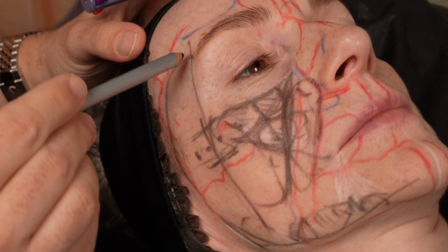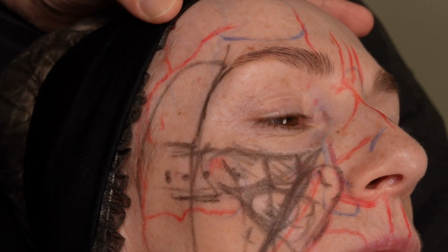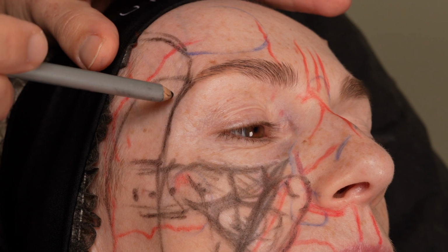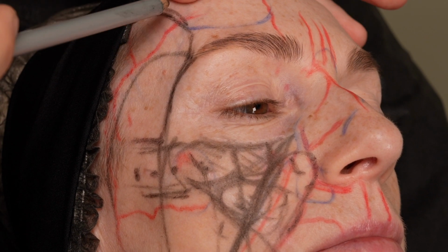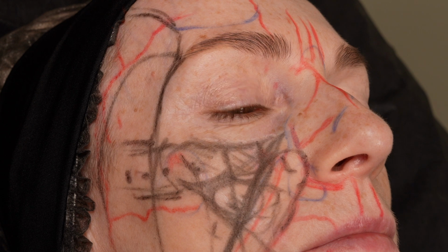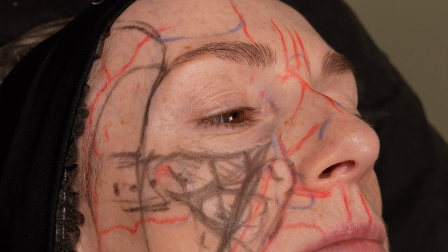Temple area, here is the temple: upper border of the zygoma, lateral orbital rim and crests, temporal crest. Here is the temple area. I told you we can work with the gunshot technique. Also we can use subcutaneous injection, where there is an artery. It's a little bit dangerous. And also we can inject in the interfascial layer.